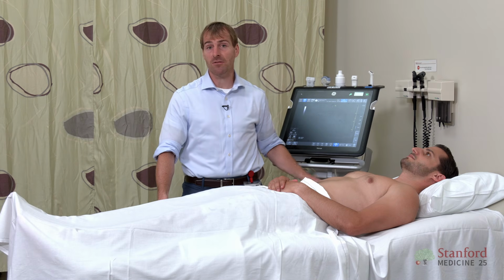Hi, I'm Dr. John Kugler, and this is the Stanford 25 Ultrasound series. Today we're going to be talking about how to estimate the central venous pressure by visualizing the IVC.